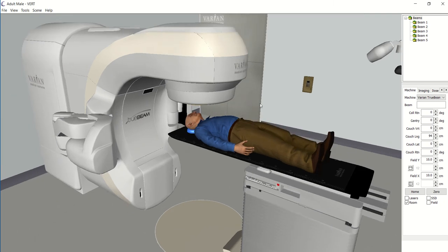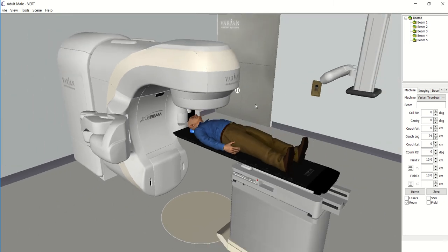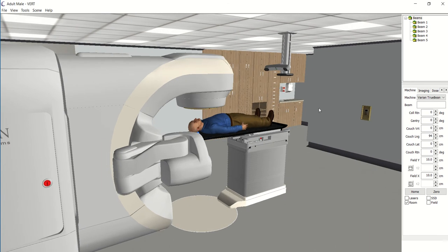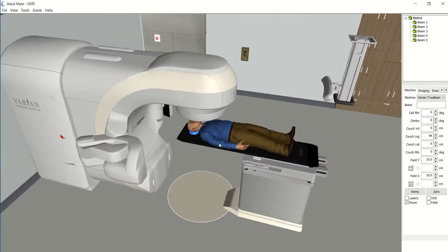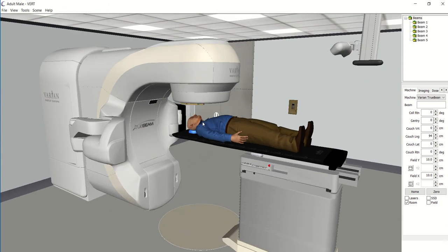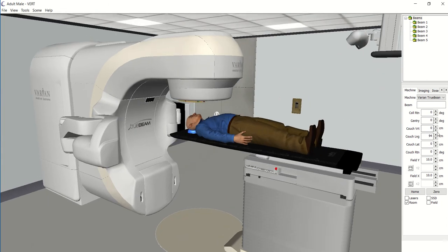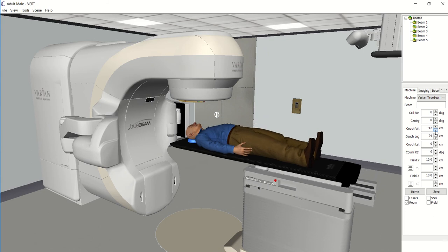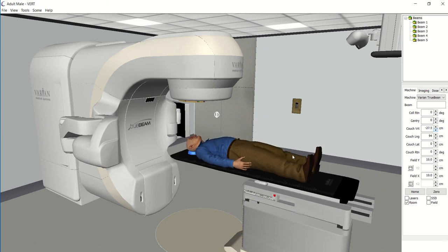So here is our standard radiotherapy treatment room. So we'd be coming in through this door. Here is our lovely patient, and they climb on to this treatment bed, and then we can raise this up and down. And it does move that slowly in real life as well.